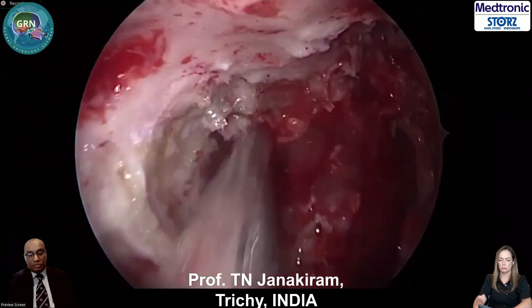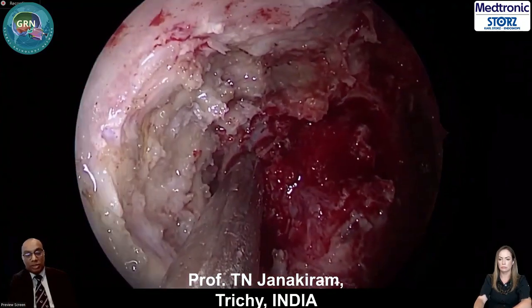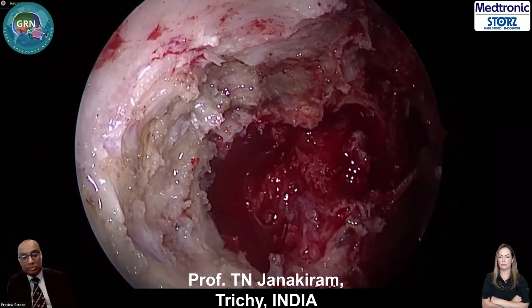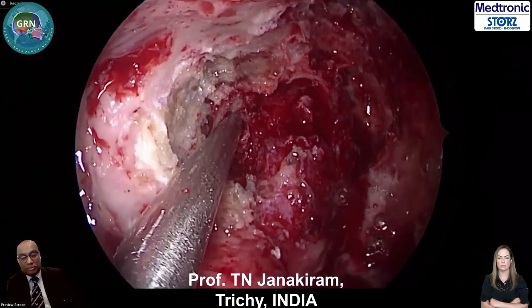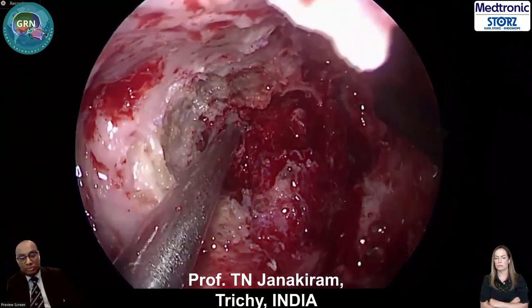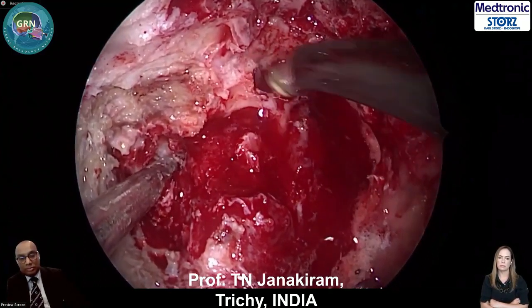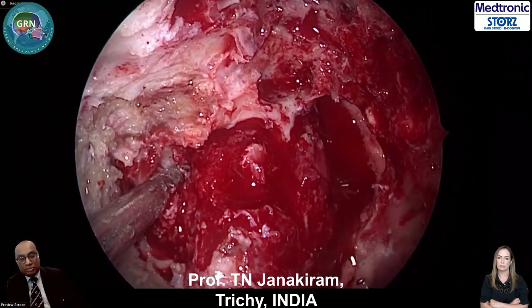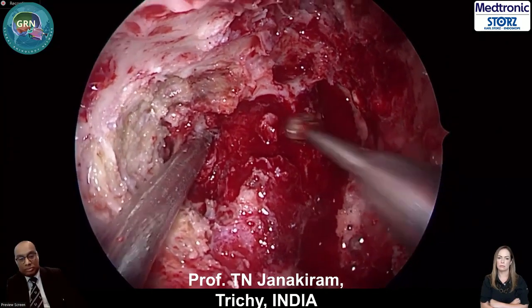That's it. I'm ready now for the tumor. I've gone lateral. Give me the coblation. Now I'm ready. That's the medial aspect of the tumor. That's the lateral aspect of the tumor. I'm now going to take off the intersphenoidal septum. That's the intersphenoidal septum there. Drill. If I take that out, I'm done with the exposure completely.